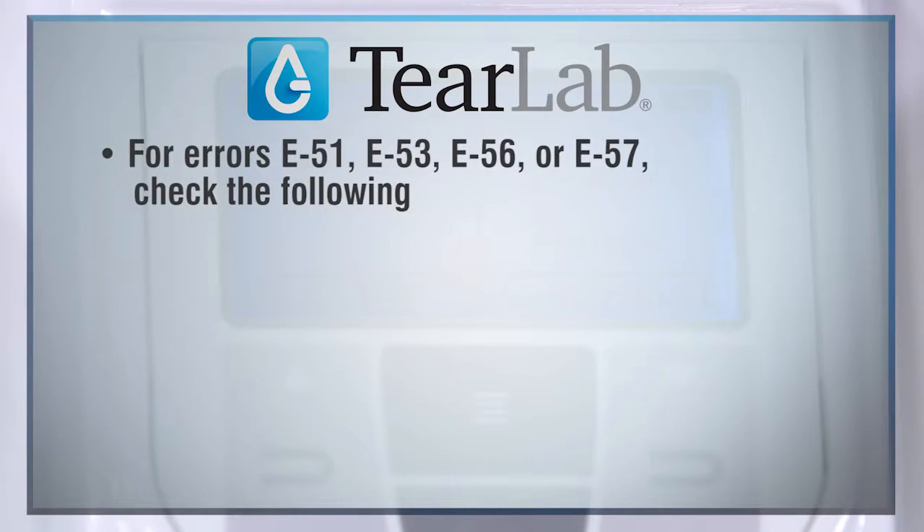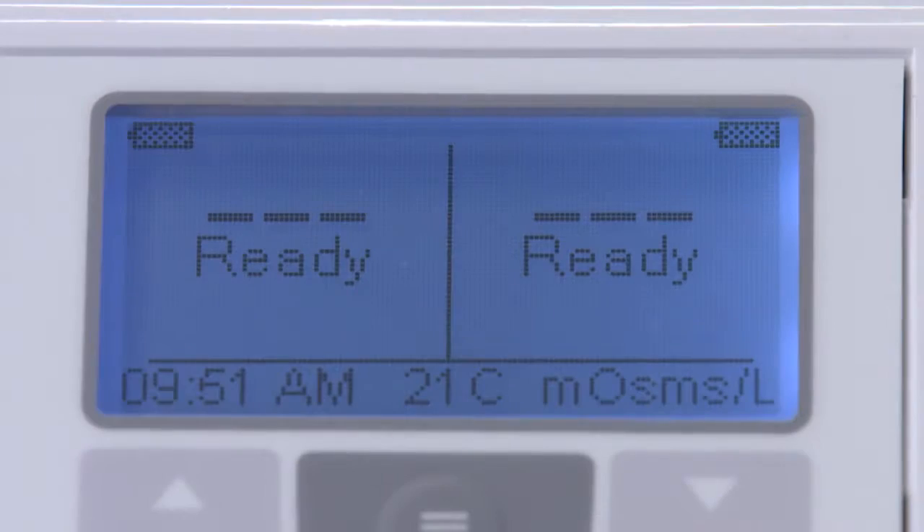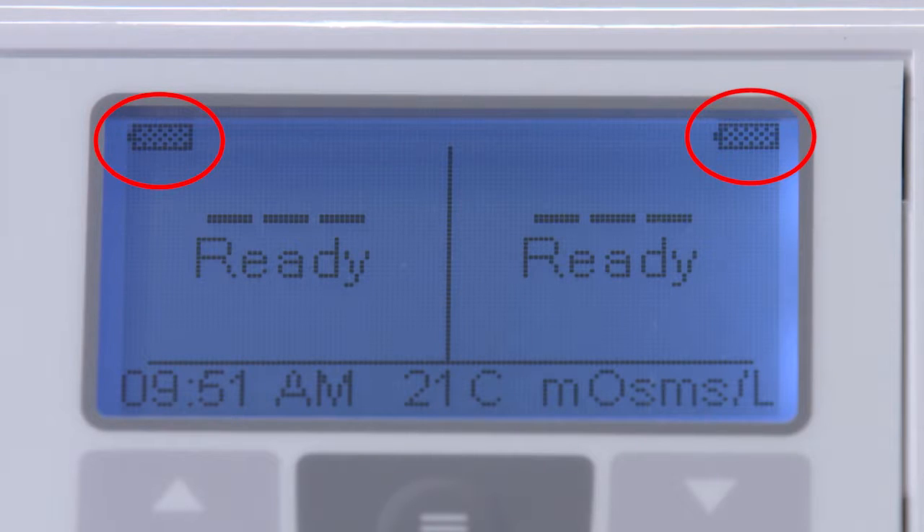For errors E51, E53, E56, or E57, check the following. Confirm that the pins are fully charged, indicated by a solid non-flashing battery icon located on the upper corners of the reader LCD when the pin is docked in the reader.